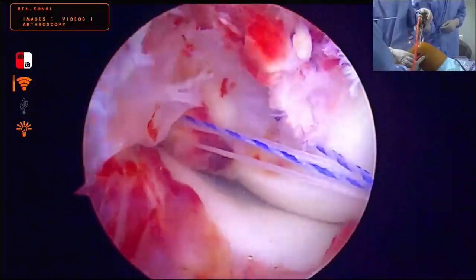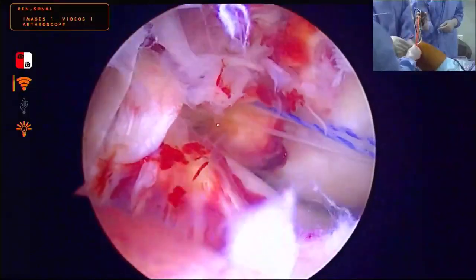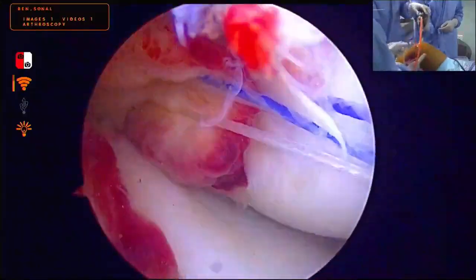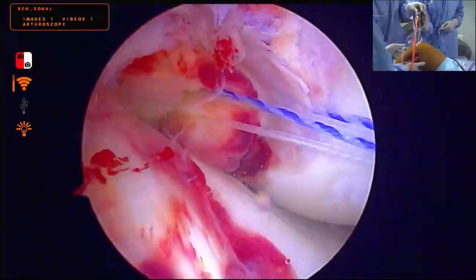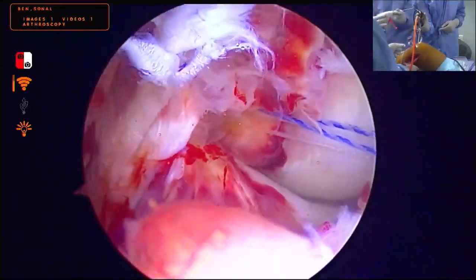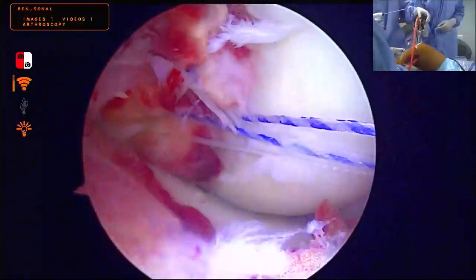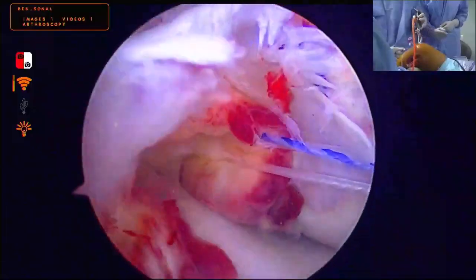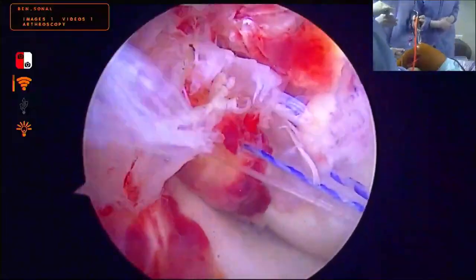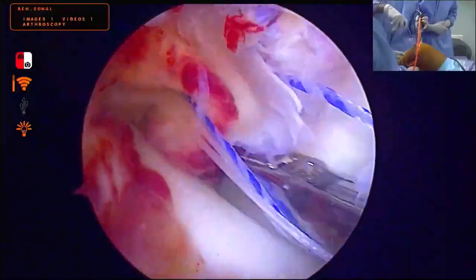Pull all the three a little bit. So when you pull it, relax. So you can relax. Like this. So looks good. Okay, looks good. Probably I'll go a little down. Leave it. Give the green retriever. Above, I have more space for one more to put. So I'll plan to go more inferior.